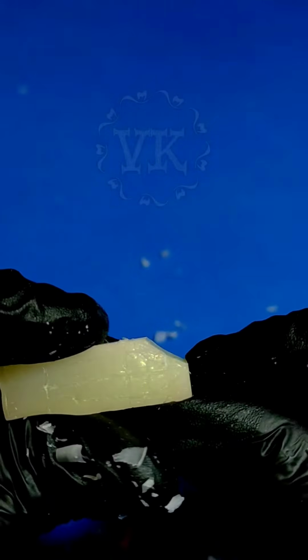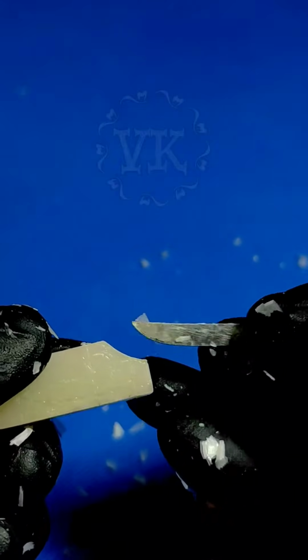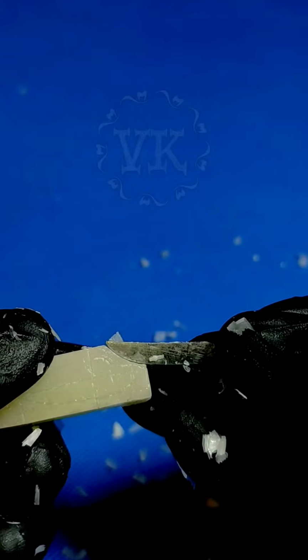You can see it's not flat anymore, it is beginning to look like a concavity. Okay, that's what I'm talking about. It's actually matching the shape of the carver.